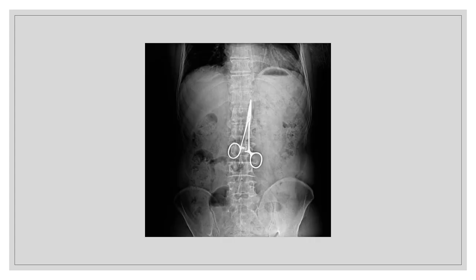What type of artifact? A little tricky. Is this inside or on top? Not sure. Would need a lateral to confirm. We're going to say it was left inside the abdomen. So that would be internal.